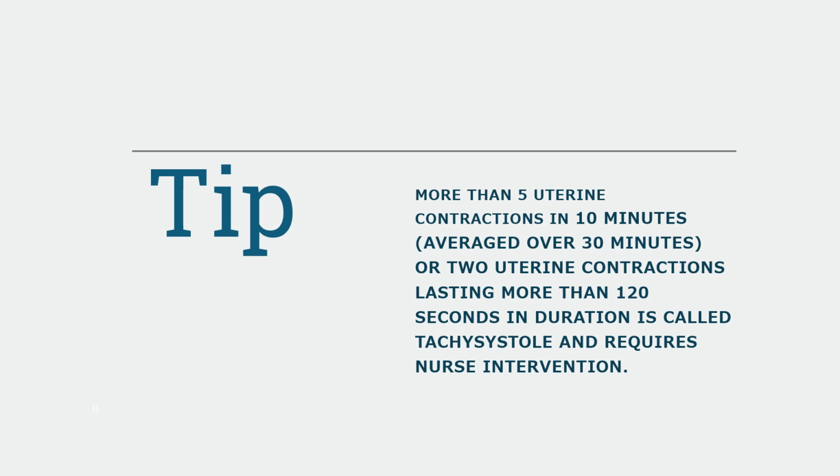But if you have an oxygenated fetus, you determine that, and you have tachysystole, okay, you probably want to turn it down. If it's going on longer than 10 minutes, you have that 30-minute window. But what's going to happen is you're going to lose oxygenation. When the patient has tachysystole, the uterus is not relaxing. I want you to think about it as the baby is holding its breath every time mom has a contraction. And if she's contracting every minute and she has tachysystole, the baby's not getting very much oxygen during that time.